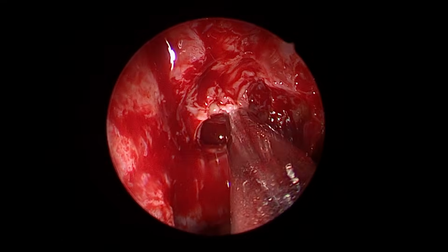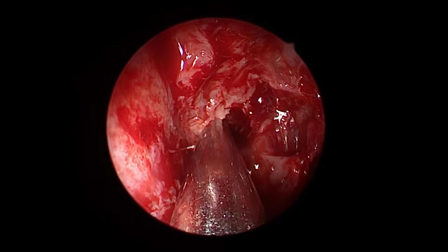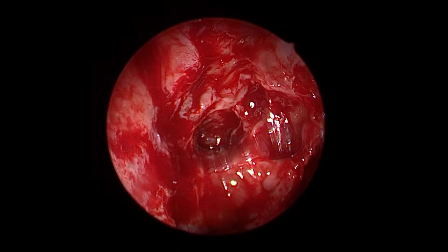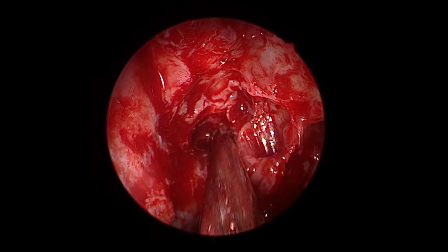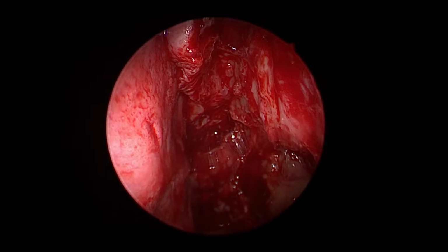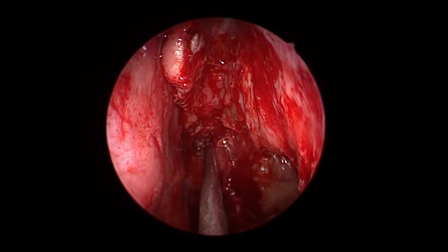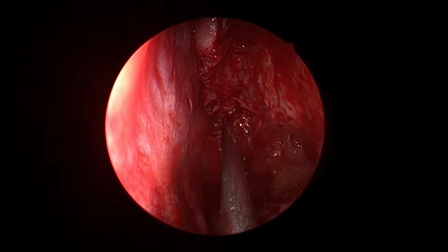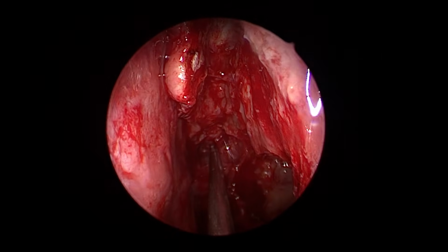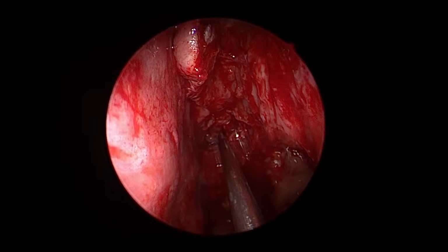See now, I am widening the sphenoid. Thick because of osteitis. See the sphenoid sinus. Now this anterior wall, I will widen and flush it so that, see my full house FESS now. You don't need any radiology afterwards in future. In your office you put the 0 degree and you see everything that you have done.